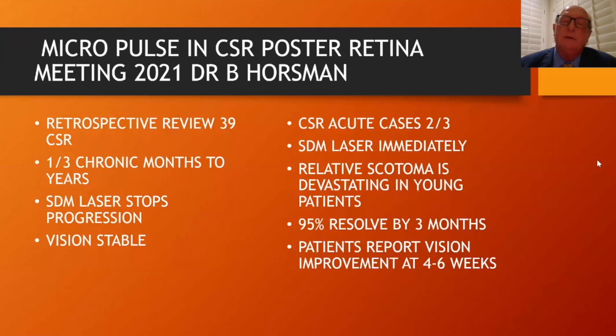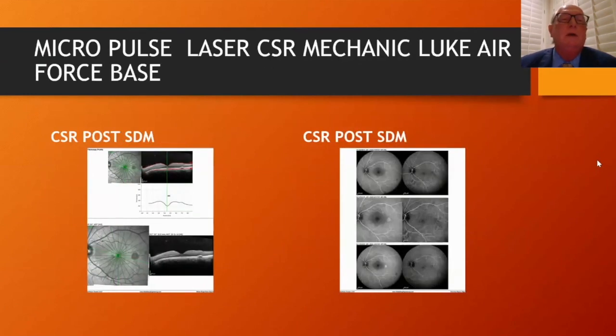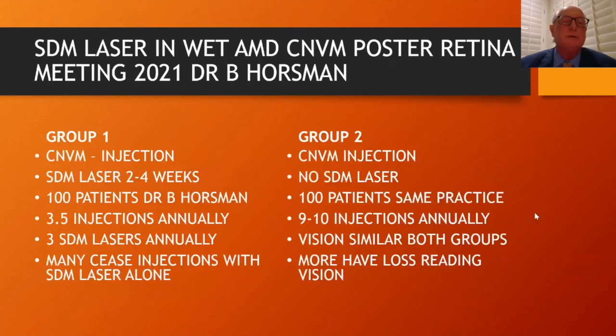Patients have reported to me that the resolution begins around a month. In the early days, I was seeing them back in a month because I was curious to know how much the fluid had reduced. The slide you see now is a mechanic at Luke Air Force Base locally, and he presented with a rather large patch of subretinal fluid in a central serous and a tiny pinpoint leak you can see on the fluorescein. There's kind of diffuse damage on the ICG, difficult to know precisely what this means. When I saw him back at 3 months, he had actually been posted to a non-North American base for a few months, and it was a bit later when I saw him. The fluid had resolved in the fovea. He was dramatically happy. There's a small little patch of fluid that you can see there, which is insignificant. It's not in the fovea, and the leak pattern has stopped completely on the fluorescein.